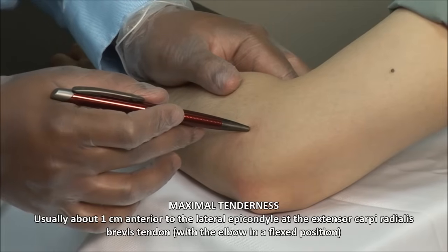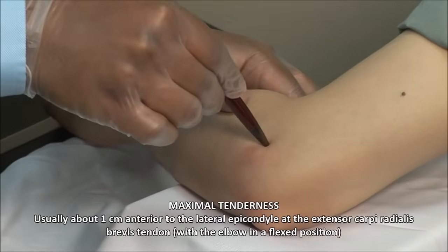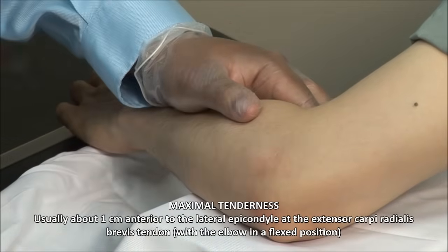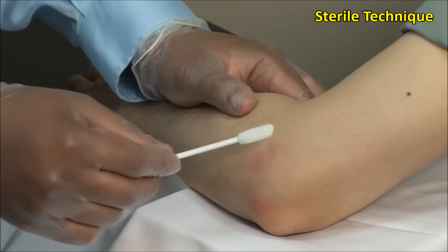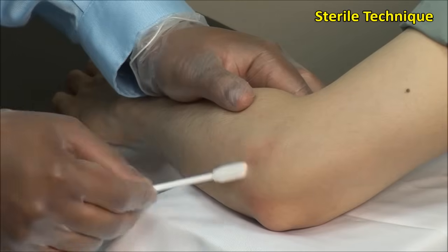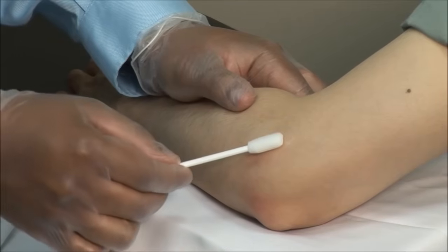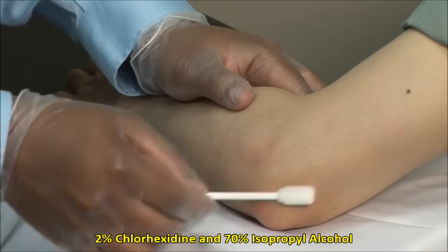Use a retractable pen to mark the point of maximal tenderness. These injections should always be done using sterile technique. Scrub the site of injection and then clean in an outward fashion. Here I am using a mixture of 2% chlorhexidine and 70% isopropyl alcohol.